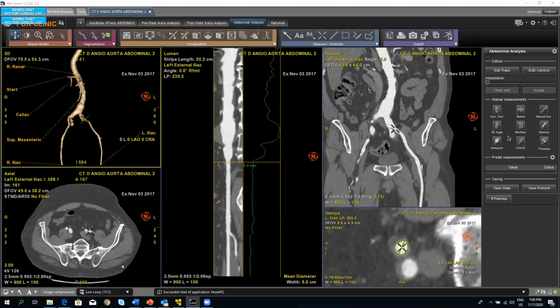So you don't have to pay, for example, to have an aneurysm segmentation. If you have an AW, by default, you're gonna have this tool, okay? So in this case, for vessel analysis, you're gonna go through stenosis analysis and aneurysm analysis and color code vessel analysis as well, and thrombus. So these features are always by default on these AW systems.